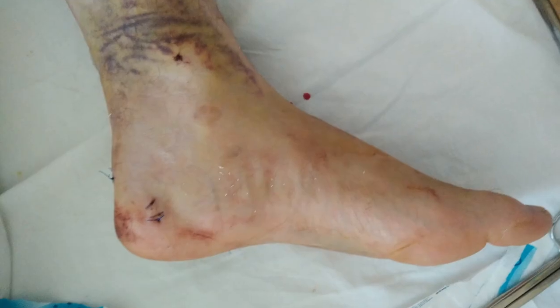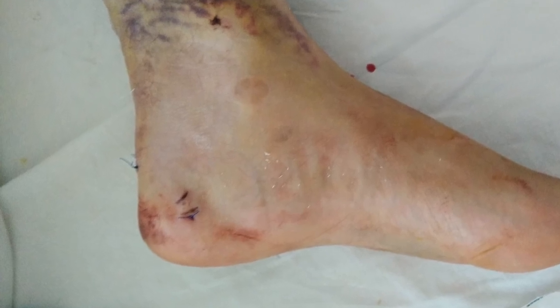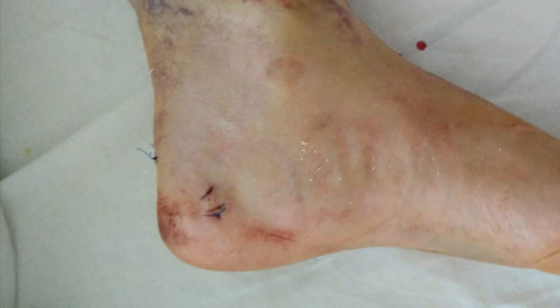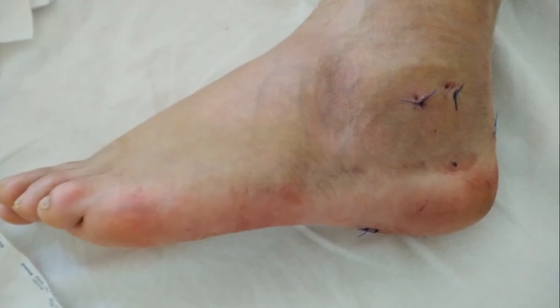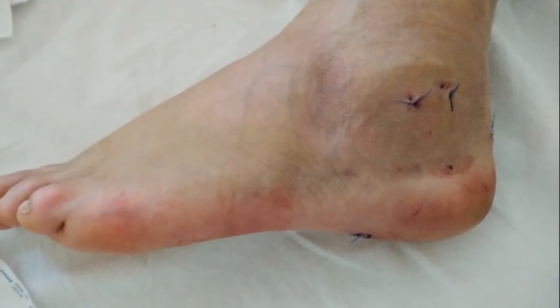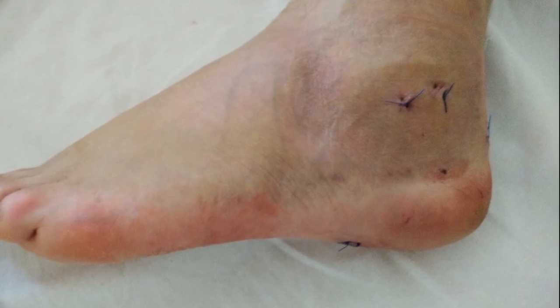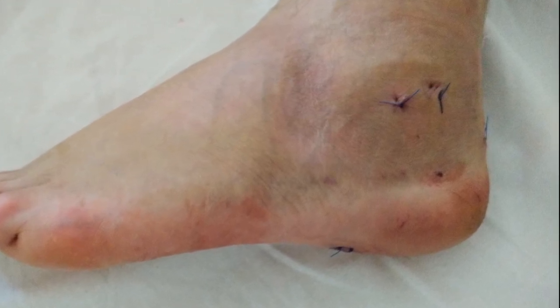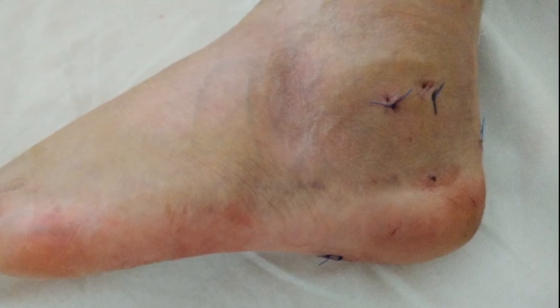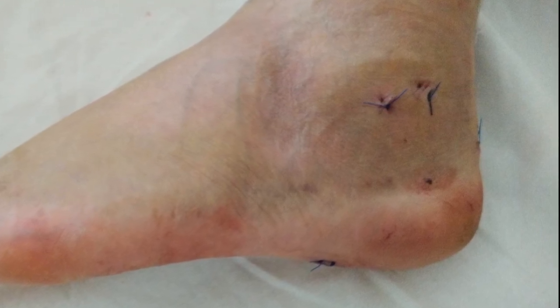In conclusion, I would like to say that use of minimally invasive reduction techniques should be rational. Often there is misunderstanding of what is happening inside. For example, an accidental rotation of one of the articular fragments makes this fragment invisible or unclear on the image intensifier.